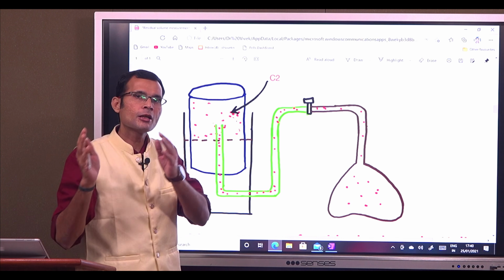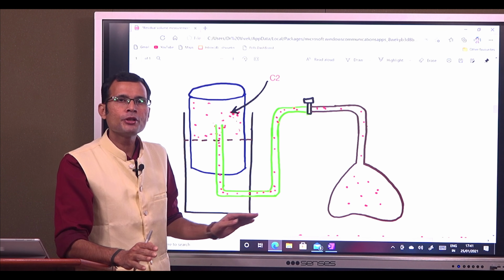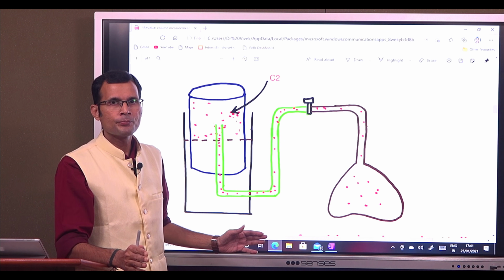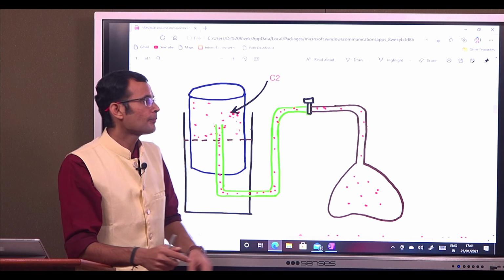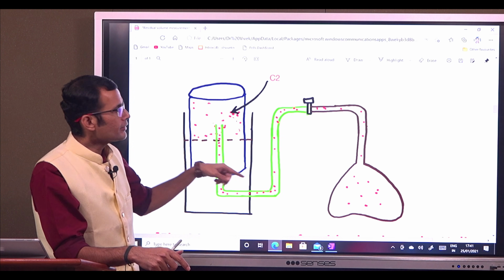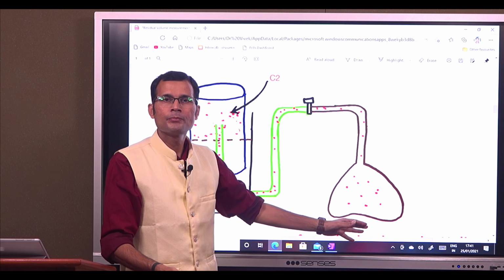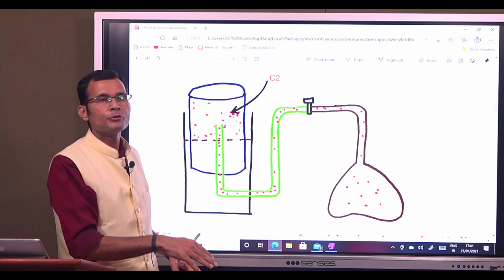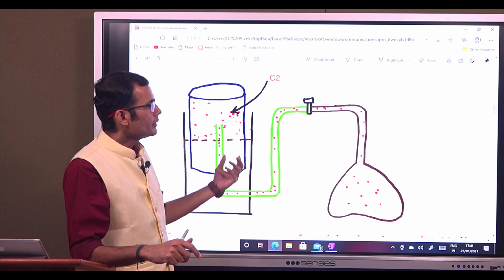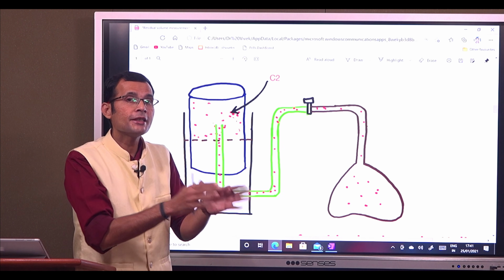That's the one compartment, V2, in which the helium is evenly distributed and reaches equilibrium. What is the meaning of that? It means the concentration of helium will be the same in the spirometer, the same in the airways, and the same in the lung. It has been uniformly distributed, and therefore you can take the sample for the concentration of helium, which is C2.